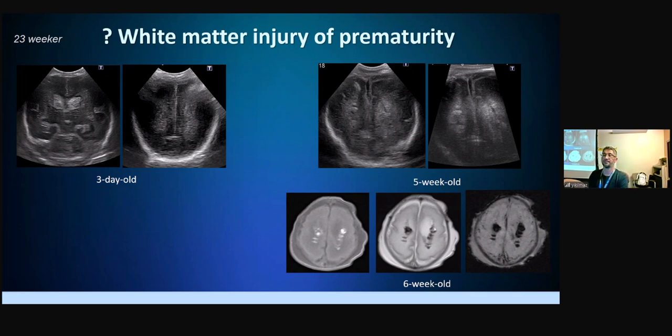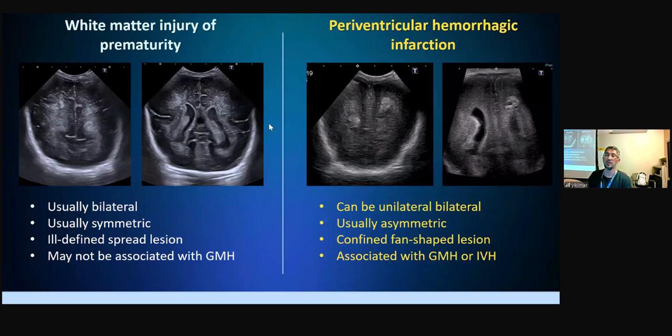Okay, Dr. Yikilmaz, do you just offer both in the differential then? Periventricular hemorrhagic infarction and white matter injury? Yeah, it's in the differential, but I think it's possible to differentiate. Most of the time it's possible. At what age do you stop seeing PVL? Is it not seen at all in term babies? I mean, in medicine nothing is never, right? But maybe, it's typically in preterm infants. I don't remember a case, but I think it's still possible.